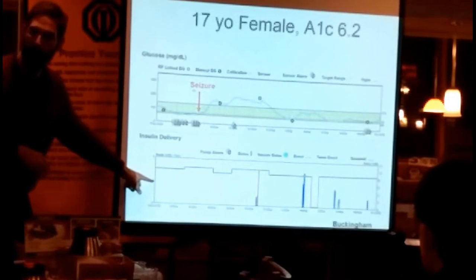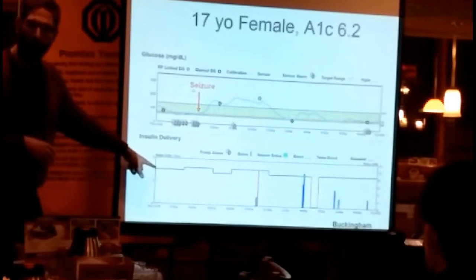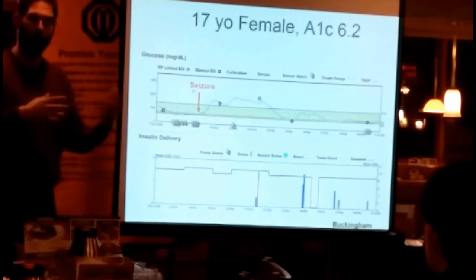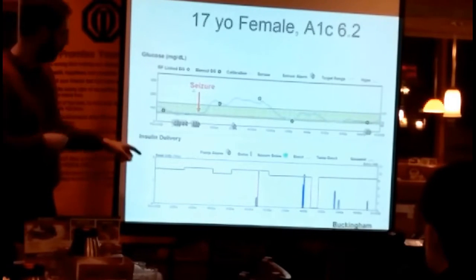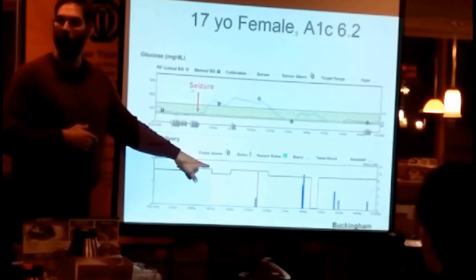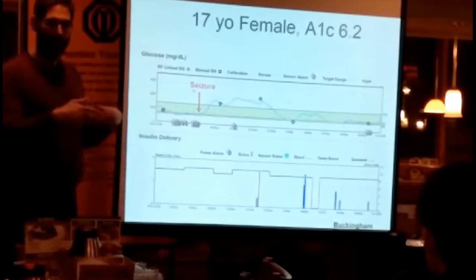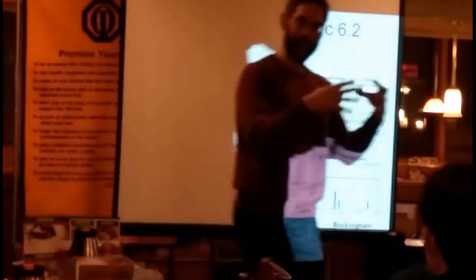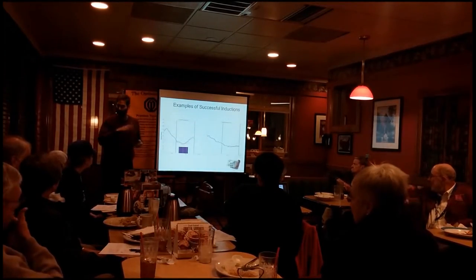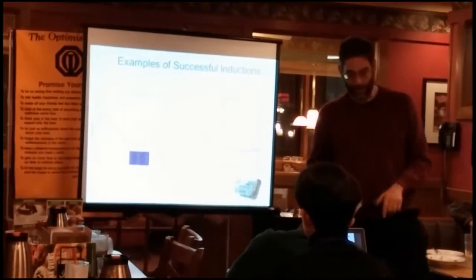Now what this part of the slide is showing is how insulin was being delivered. The pump didn't know what was going on because the pump's not connected in this case. This is an old slide. And so the pump just kept pumping the insulin in, right? We'd all like for it to have stopped right here. So keep that in mind. And that can be really dangerous when you're low for a long time. So that's just one example of how that system can work.